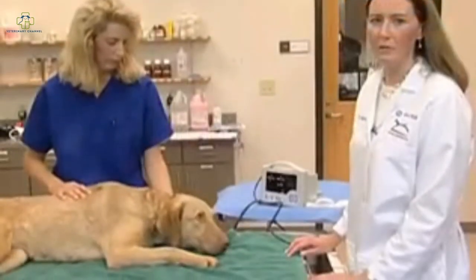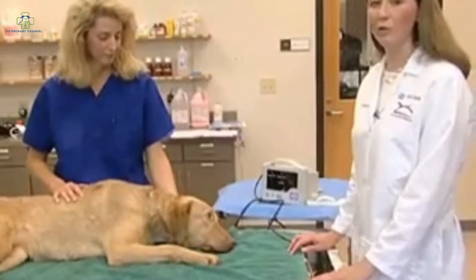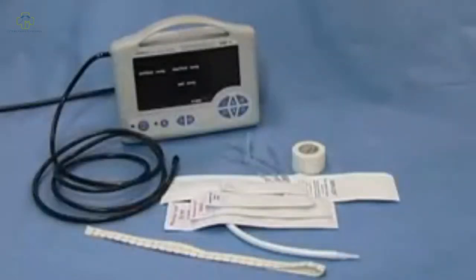The next method of blood pressure measurement we're going to demonstrate is the oscillometric method. This again requires placement of a cuff over a major artery. The best places to measure are just below the elbow, above the tarsus, or the tail in the dog. Here is the equipment required: the oscillometric blood pressure machine, a selection of cuffs, a measuring tape for determining cuff size, and some white tape.